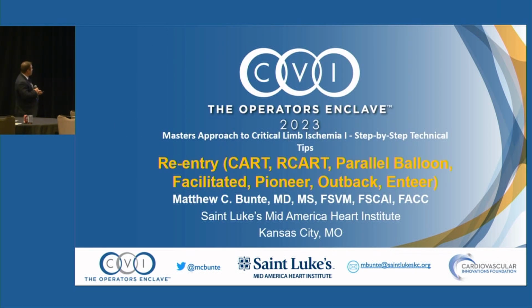Thank you. Great case. Hey, Matt, real quick about that case, just something to think about. So when you did CART from above, what I might have done is reverse CART, so I don't make that dissection plane really large. If it crosses, then great. Or try to rewire and get closer.